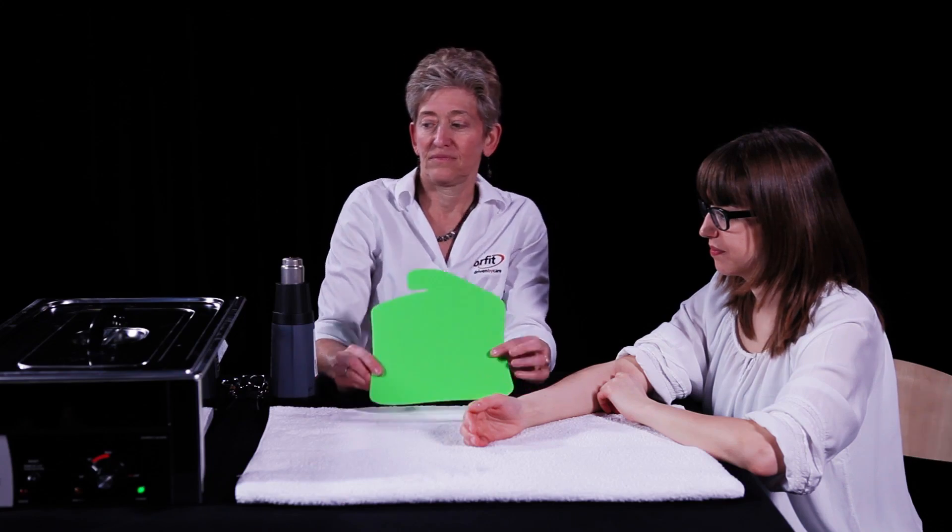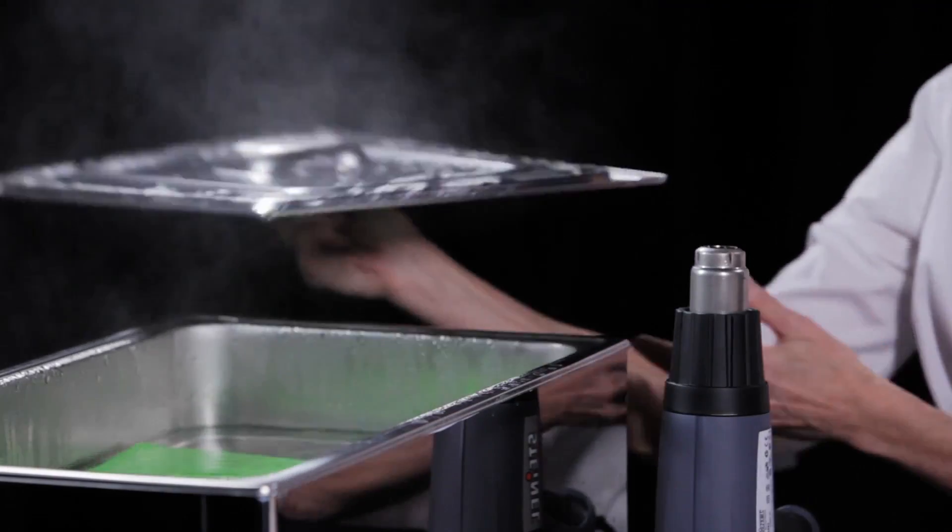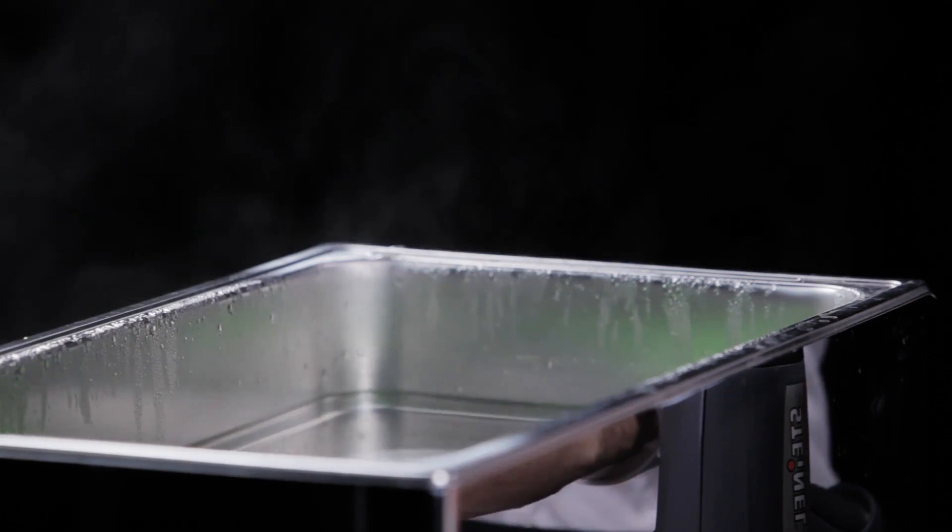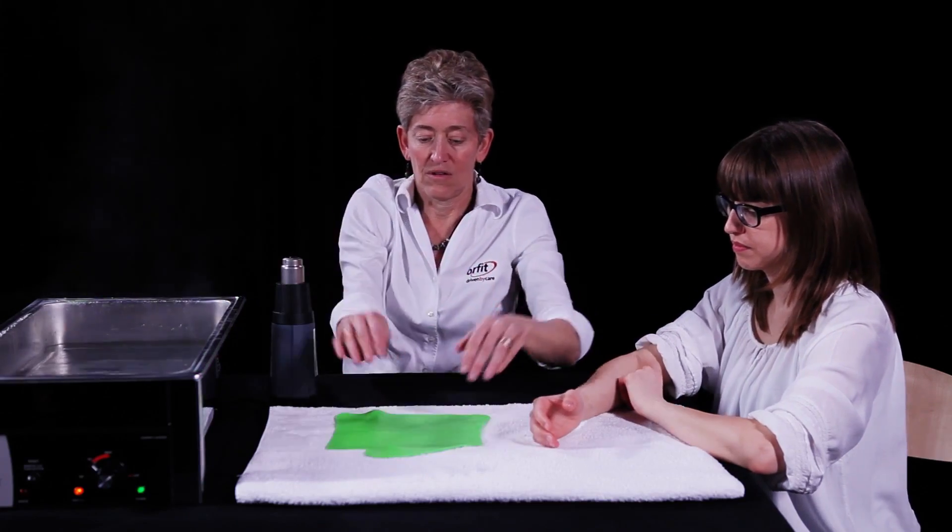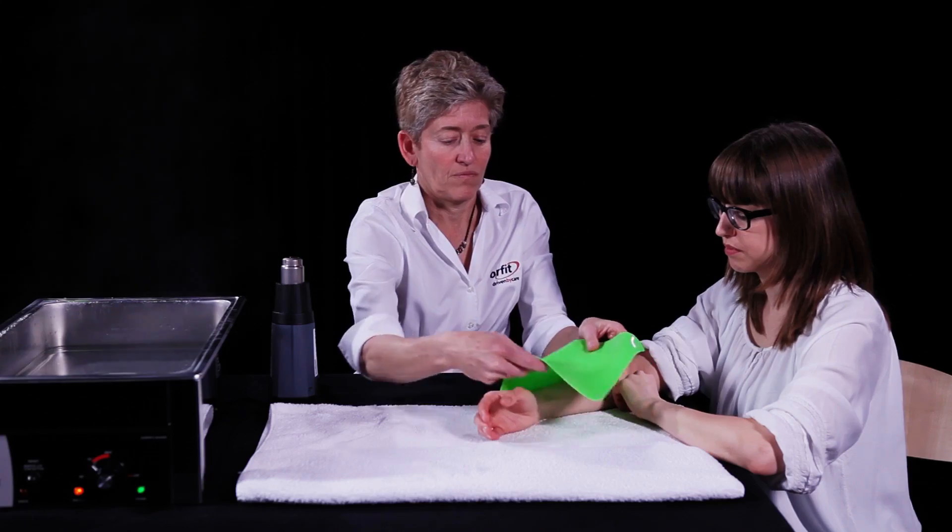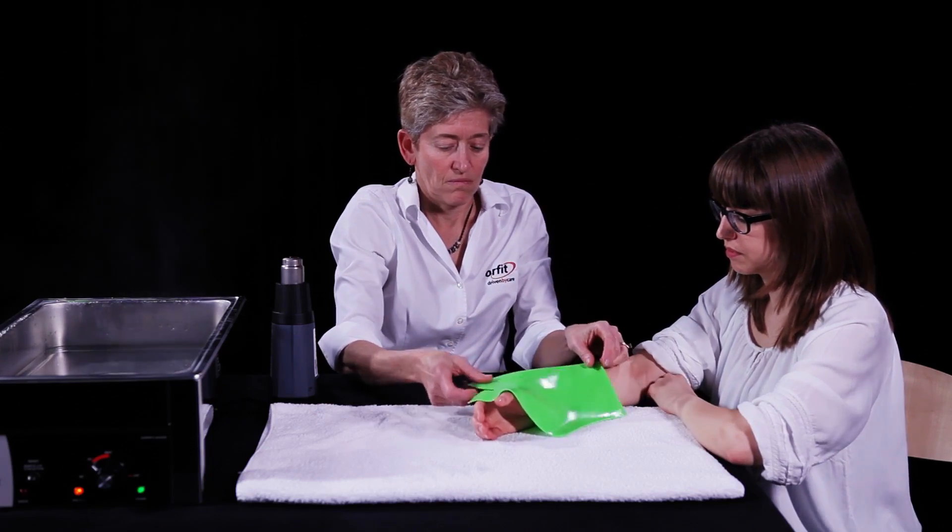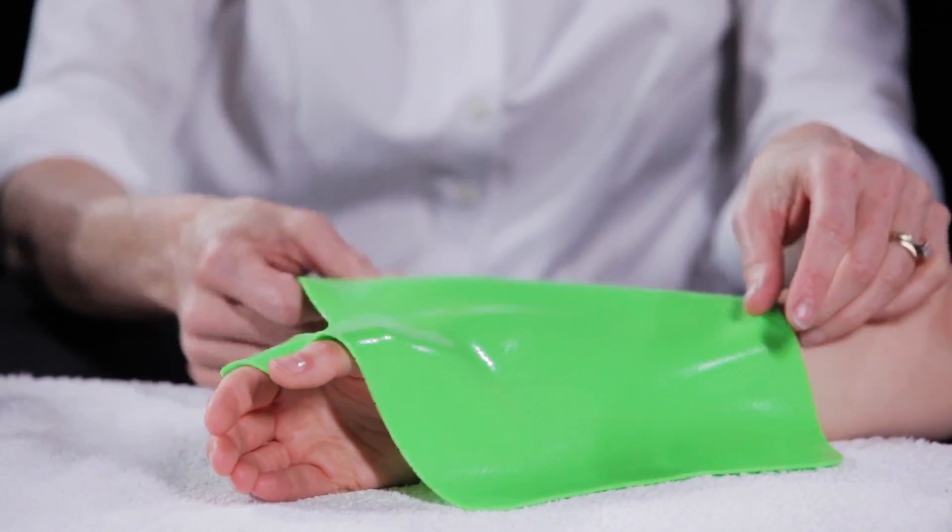The pre-cut is placed in the hot water bath to activate the thermoplastic material. Place the pre-cut over the patient's forearm, aligning the correct volar and dorsal surfaces. Place the tab cut out in the first web space.